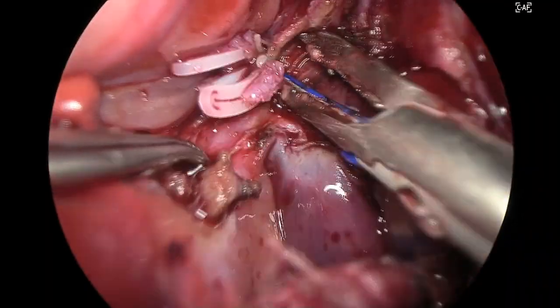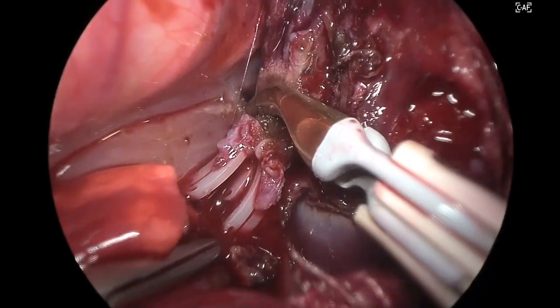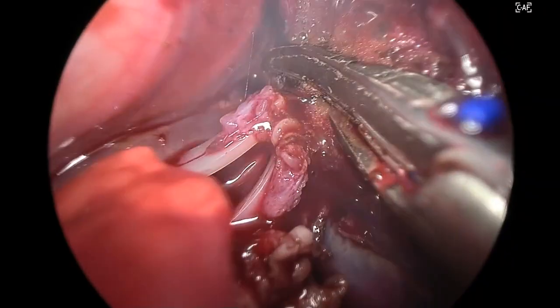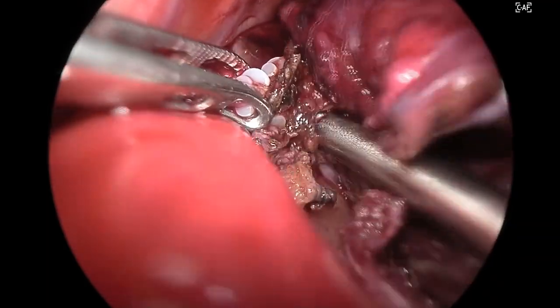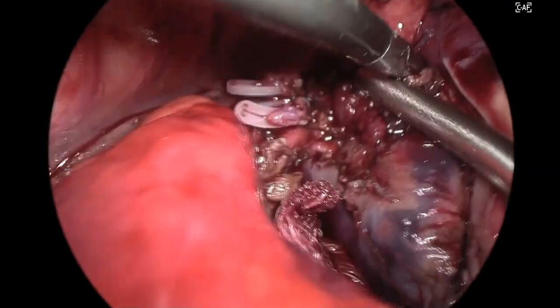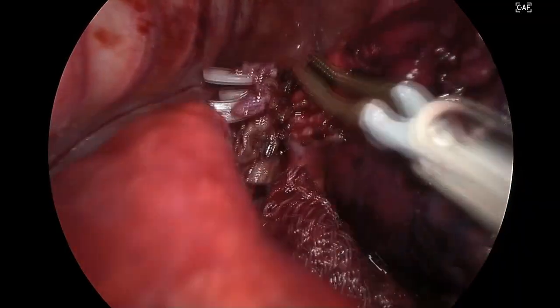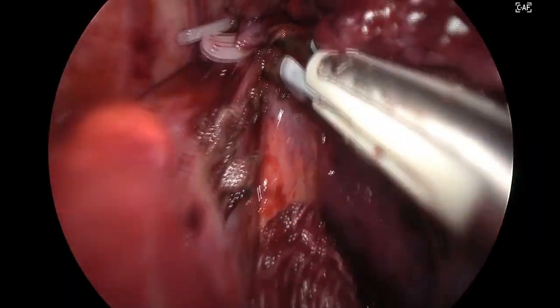Now this is probably the last obvious branch, which is again sealed and divided, and this is the remaining tissue which is divided again with a sealer. So the last bit of tissue, this is all that remains to separate this right upper lobe, and this small degree of oozing was there that I mentioned, the only drawback of handling the vein first.